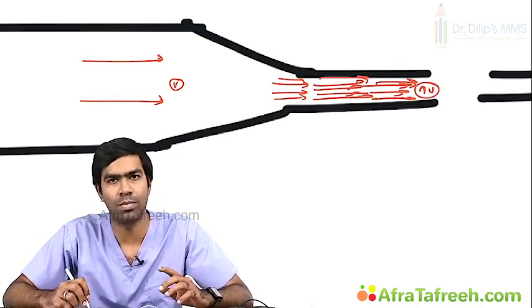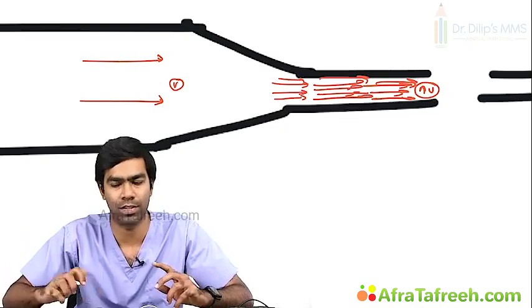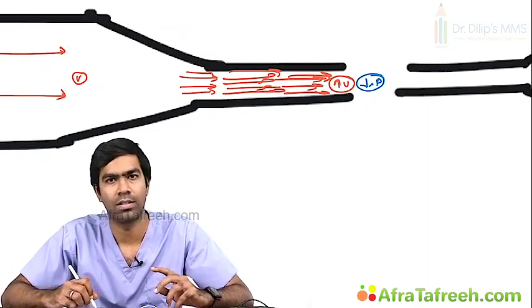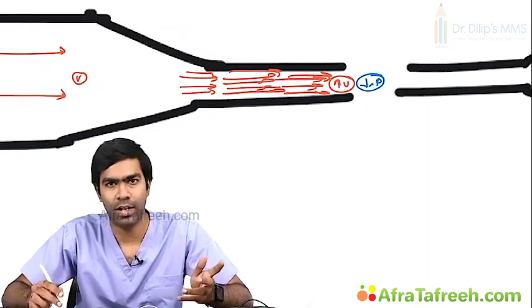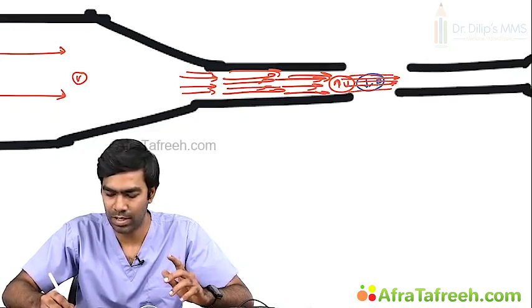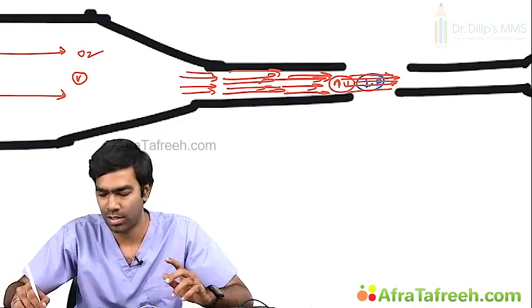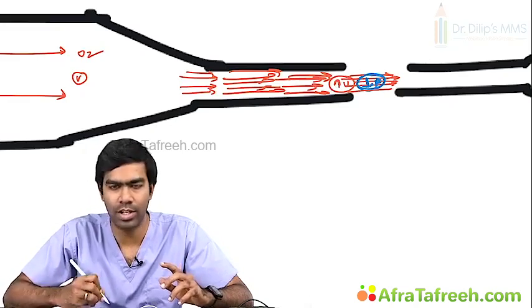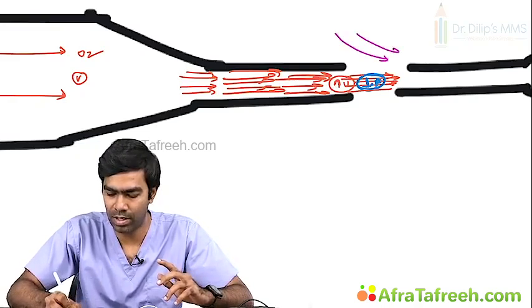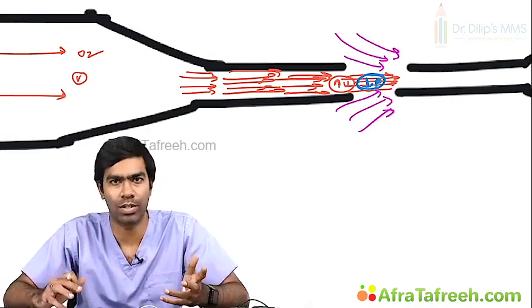I told you, this is the simple Venturi principle. They will definitely create high velocity jets whenever you constrict the orifice. As per the Bernoulli effect, there should obviously be low pressure, and you have created an orifice there. So this high velocity oxygen that is flowing creates a low pressure area in this zone, which is going to suck in atmospheric air, and this is the Venturi effect.